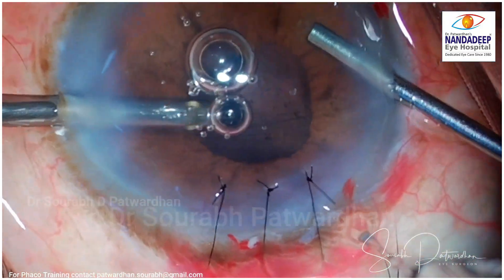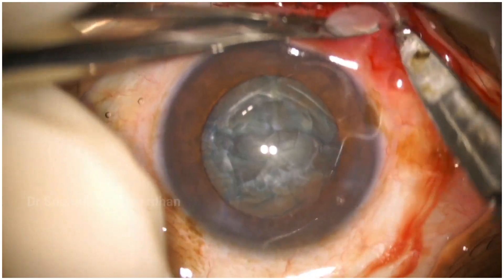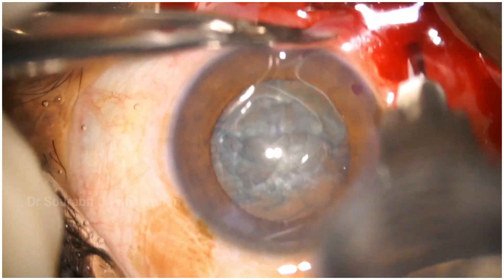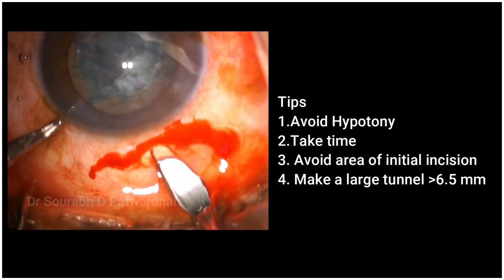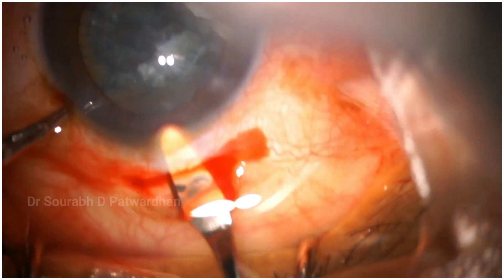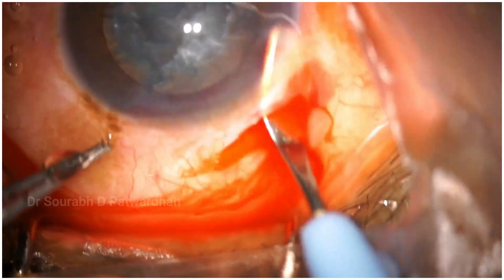Converting to a scleral tunnel is a much better option. Give a subconjunctival followed by a subtenon — posterior subtenon — anesthesia through the inferonasal site; that makes the patient very comfortable when you are making the scleral tunnel and for the rest of the maneuvers. It is important to avoid too much hypotony. Take your time, because this is not a routine scleral incision. Avoid buttonholing or too deep an incision causing premature entry, and make a large scleral tunnel.